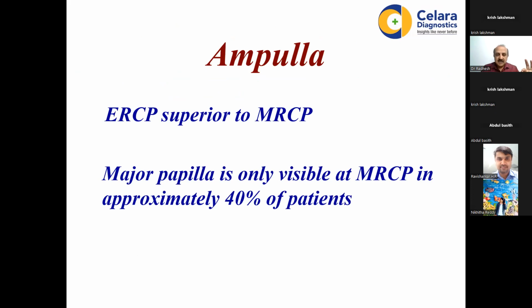So if they ask you about the limitation of MRCP in the exam, you can always say the limitation is air and surgical clips, because they don't contain hydrogen protons, you can't see them. You cannot differentiate a pneumobilia from a calculus in many cases, so you do a CT. Second, for visualization of the ampulla, it is ERCP and not MRCP.